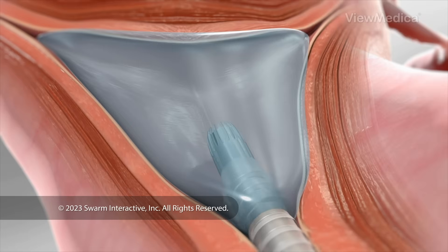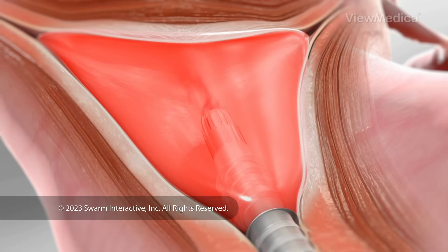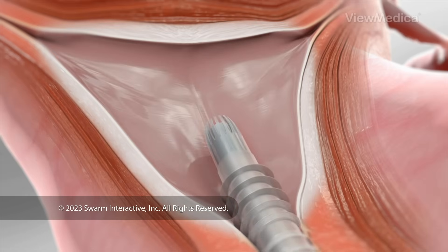Then we pump a heated fluid into your uterus. This heats and destroys the endometrium. Next, we fill the uterus with a cooling fluid. Finally, we drain the fluid and remove the hysteroscope.